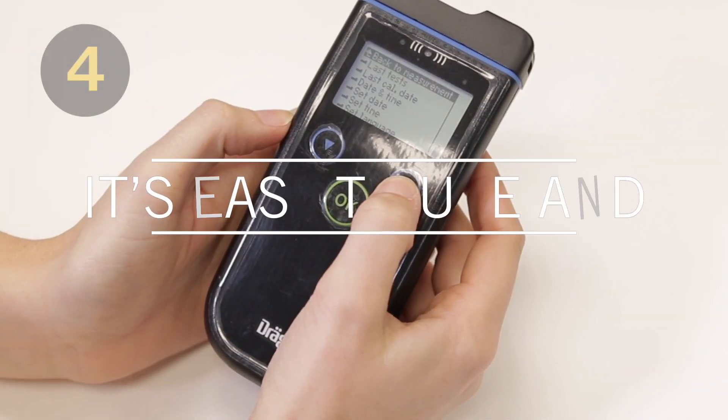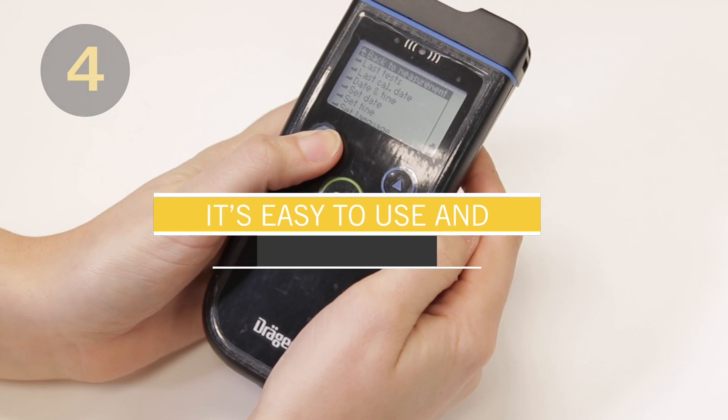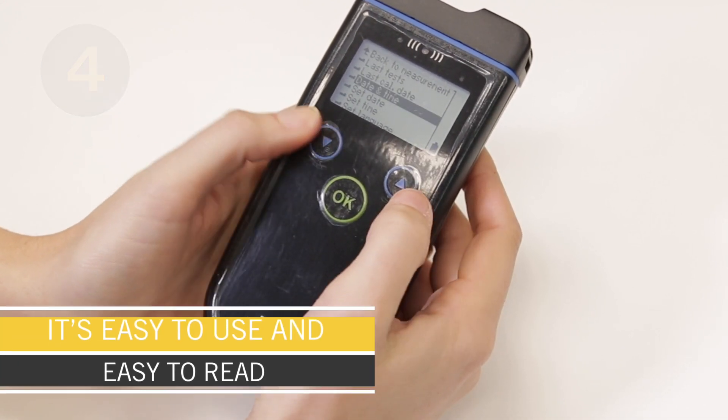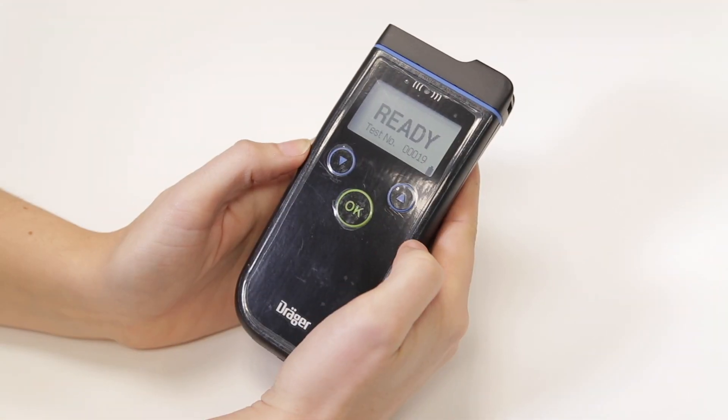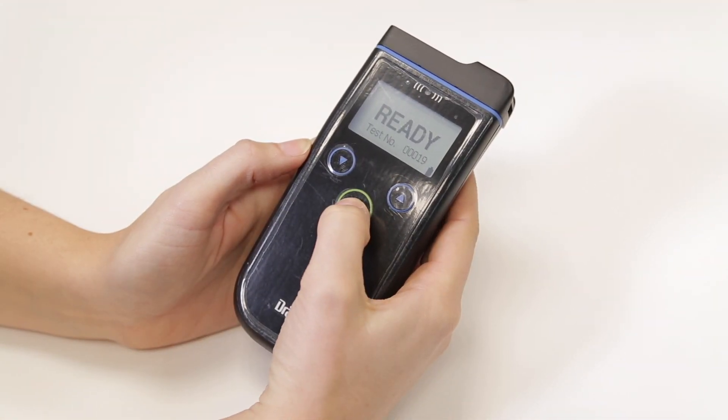It's both easy to use and read. The measurement functions are all operated with a single button, and the backlit LED display features clear full text messages.